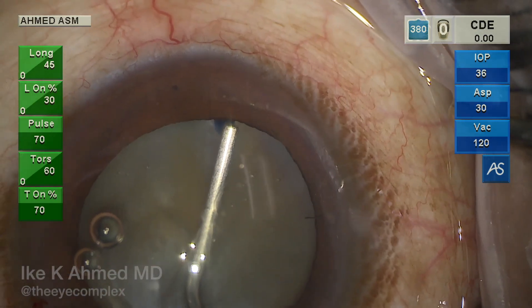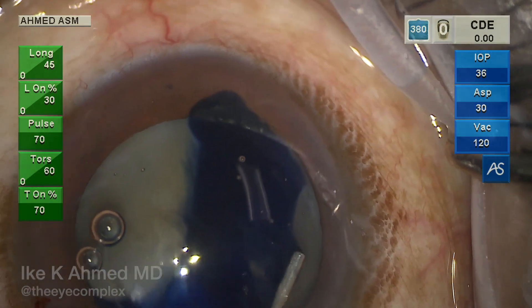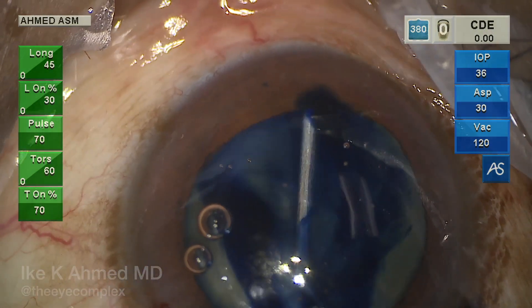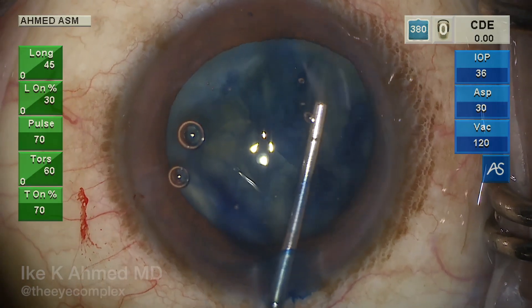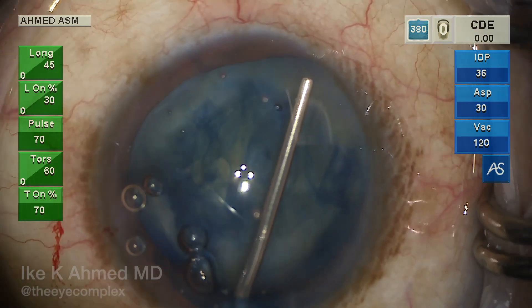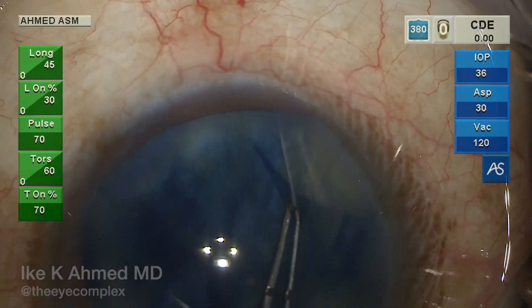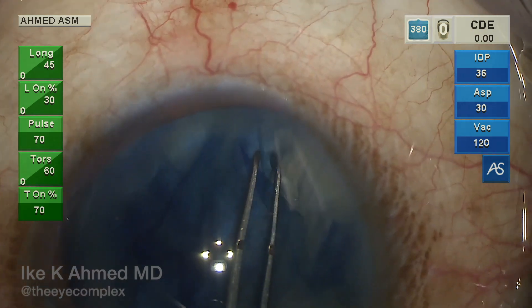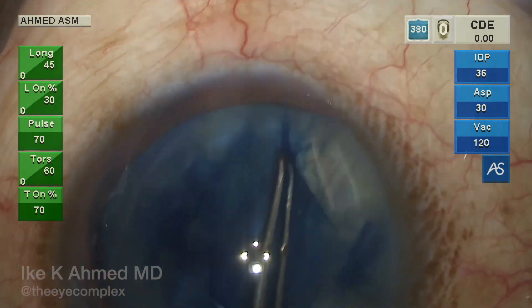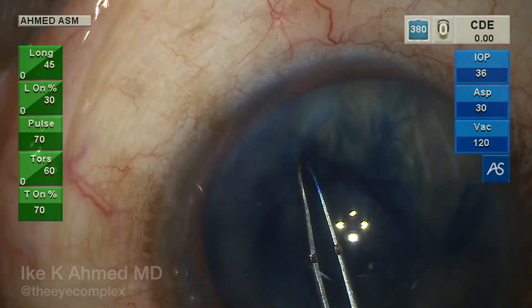Trypan blue is used here to allow us to see how far the tear has run out. This is a painting approach under the viscoelastic already in the anterior chamber. More cohesive viscoelastic is injected to help with visualization. We can see there is a very large rhexis runout. We attempt to salvage the rhexis using a stretching technique — stretching the capsule to redirect it toward the center — but there is a very large area that has run out into the capsular equator and zonular insertion, inferiorly and infranasally.